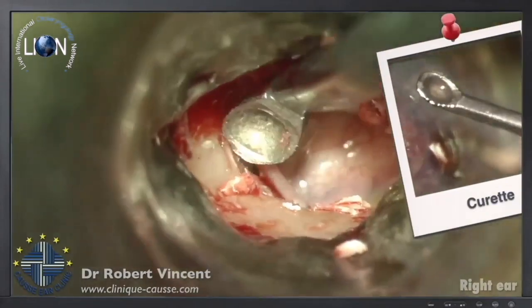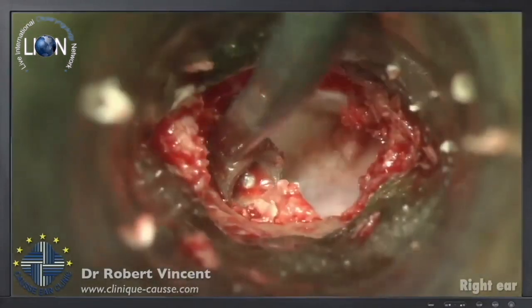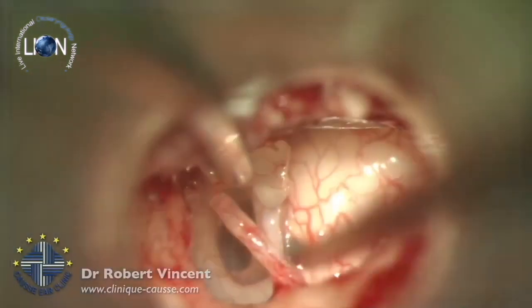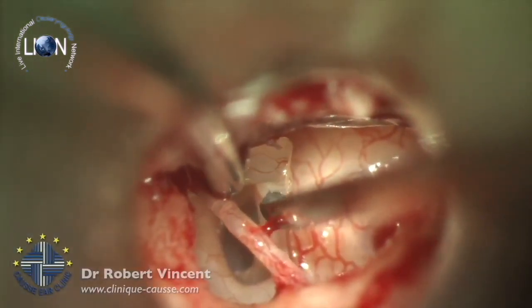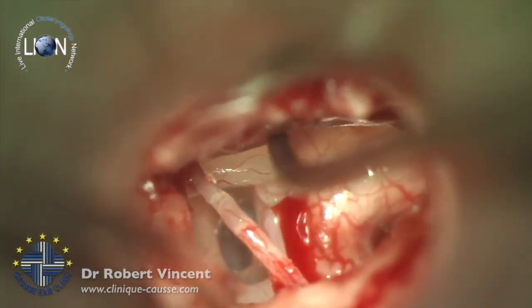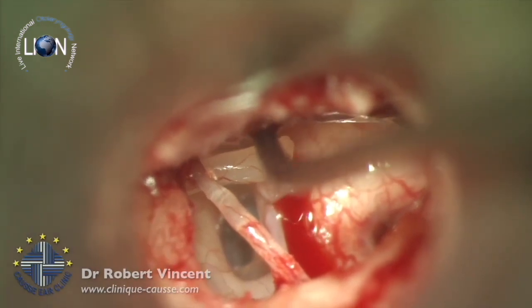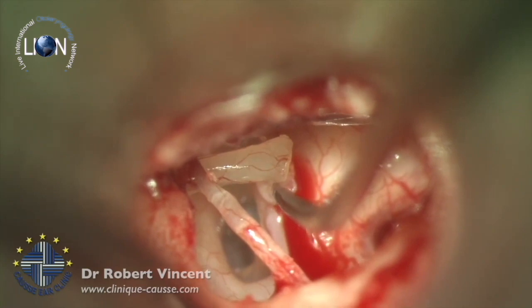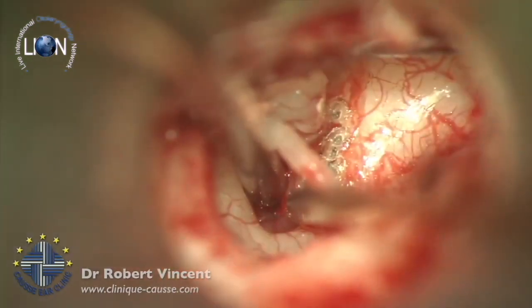The point for me is to expose the facial nerve and the pyramidal process of the stapes tendon. So I use this curette to do the bone resection. For me, the most important thing is the exposure, like this. So I need to see the facial nerve on the left and the pyramidal process on the right. Starting with the incudostapedial joint separation, then checking the malleus incus mobility, and then the stapes from the top of the head of the stapes.